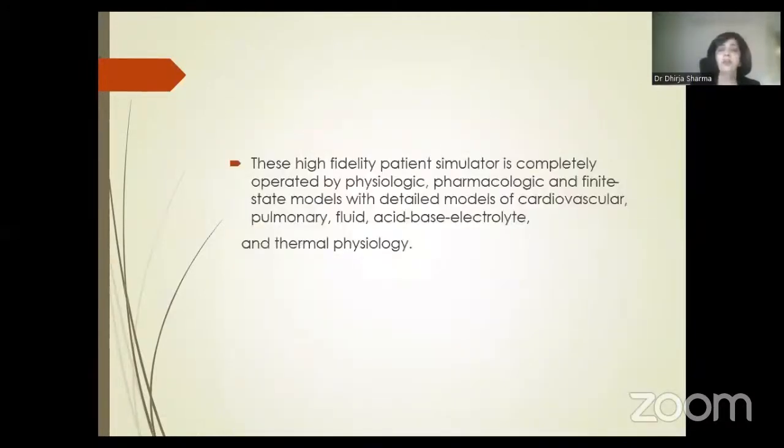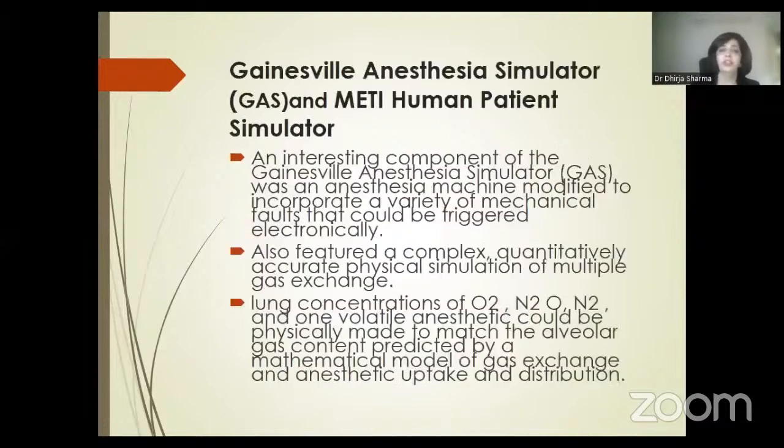This high-fidelity patient simulator is completely operated by physiological, pharmacological, finite state models and detailed models of cardiovascular, pulmonary, fluid, acid-base, electrolyte, and thermal physiology. So, depending upon the action done by the trainee, the patient's physiology shows a differentiation and further action can be done. Then there are the Gainesville Anesthesia Simulator and the METI Human Patient Simulator.